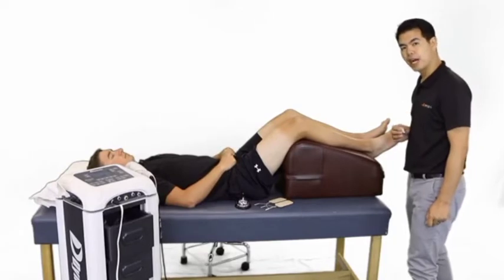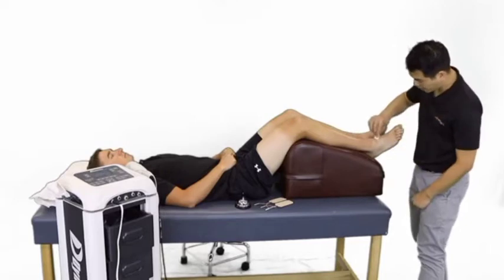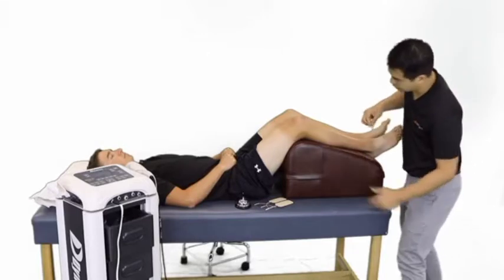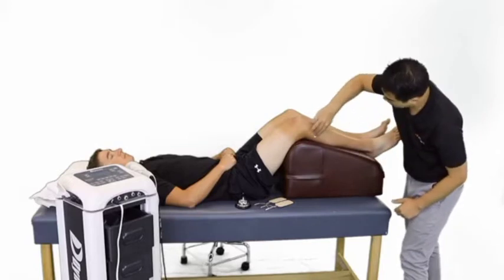Preparation of the skin for high voltage pulse current. We have swelling at the ankle. We're going to apply the active electrode here on the dorsum of the foot, so we're going to clean the skin. And the dispersive electrode will be applied here at the lateral portion of the proximal tibia.